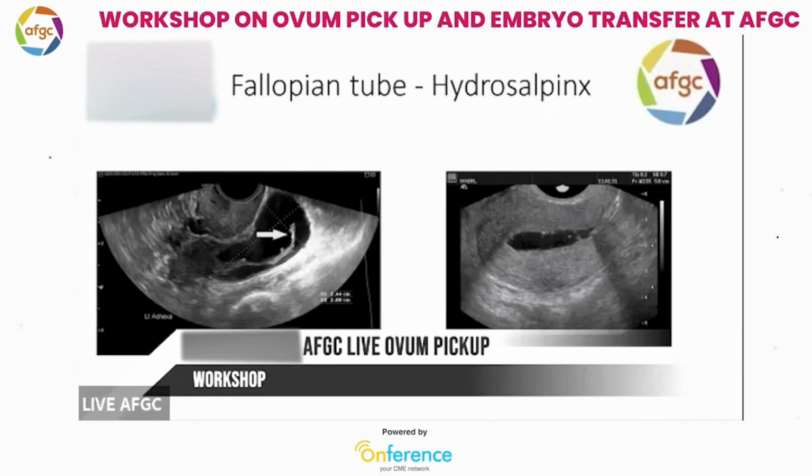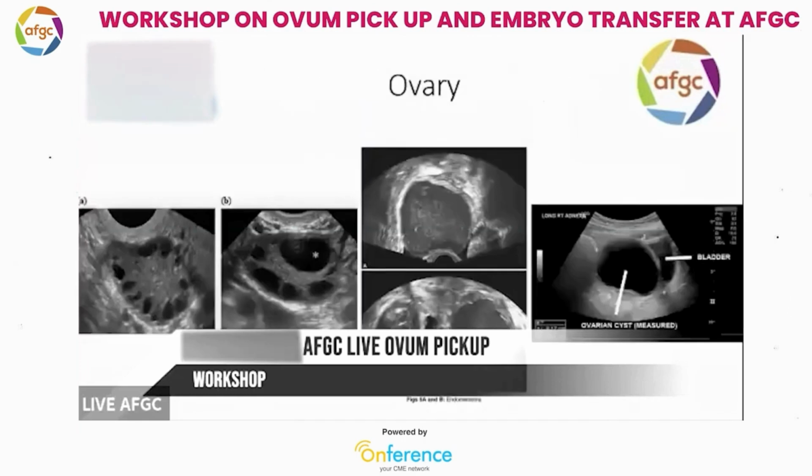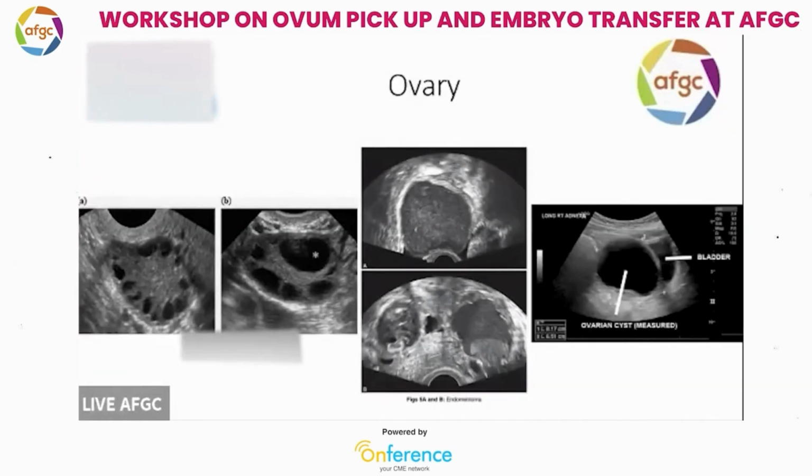One is during the early part of the menstrual cycle and one is mid-cycle, to first see that there are no cysts, then the endometrial thickness, then polyp and fluids. So we hope we get a patient where I can show you Hydrosalpinx. While we go back to endometriosis.